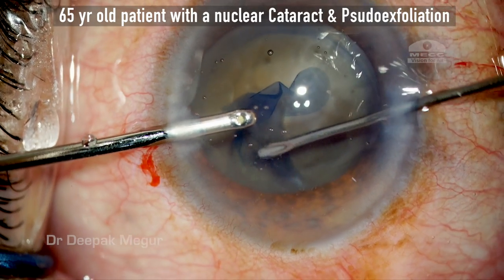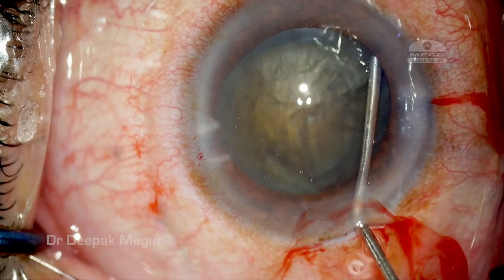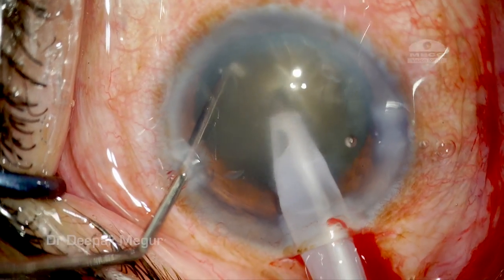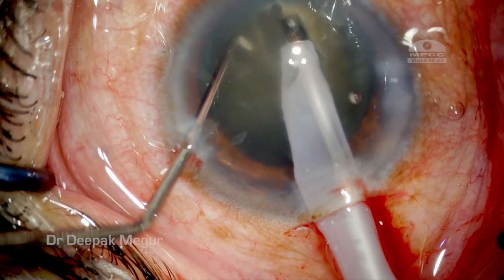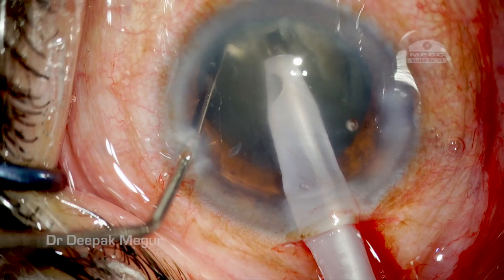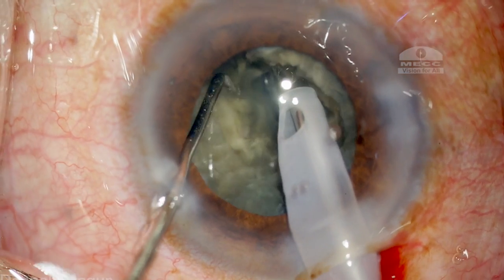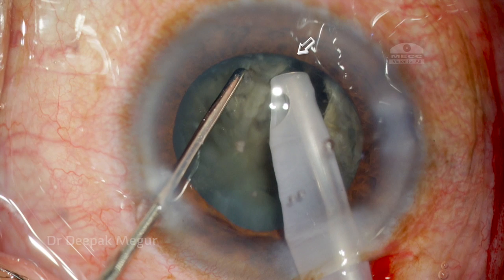My rhexis turns out to be a little bigger than what I would have liked. In these denser nuclei, my preferred technique is stop-and-chop. Whenever a PC tear happens, it's quite challenging to find out exactly at what step it occurred, and it took me multiple reviews to come to this conclusion. I'm slightly separating the two hemi-nuclei and proceeding to perform my first chop.